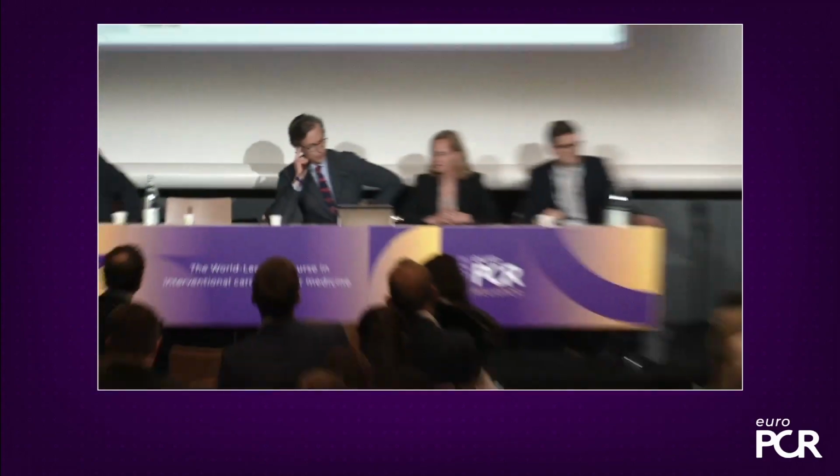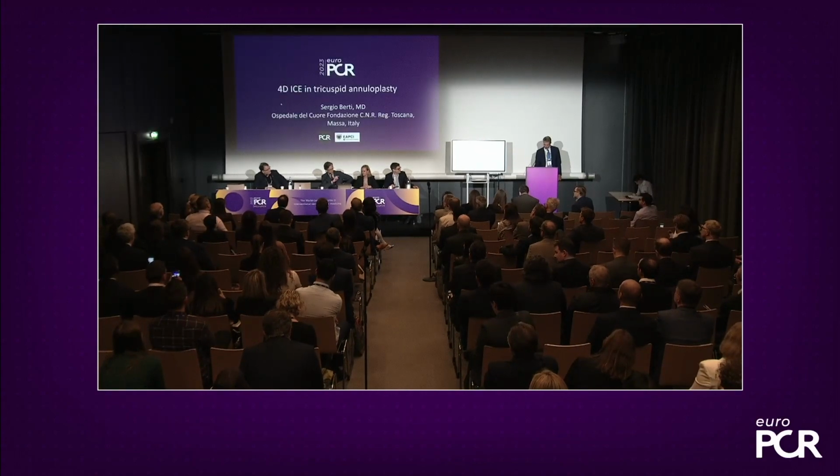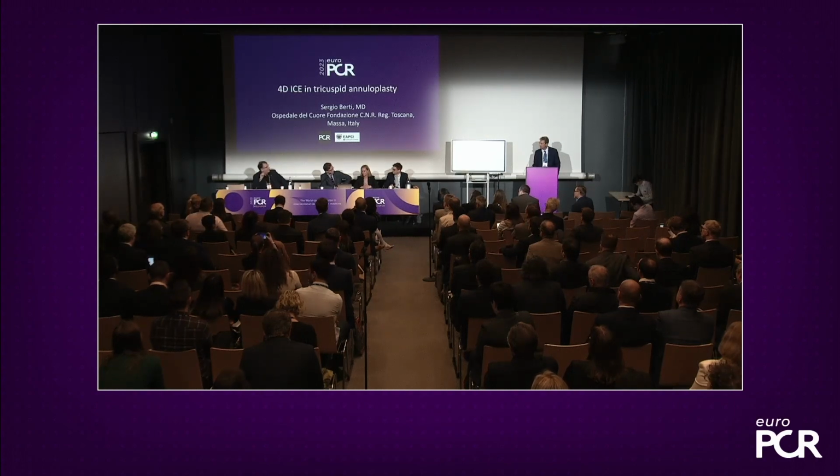Properly, there's another interesting question. What kind of anesthesia do you use for these cases? I think that really touches the point that with TOE you typically do need anesthesia and that ICE can rule it out, right? Yeah, I agree.